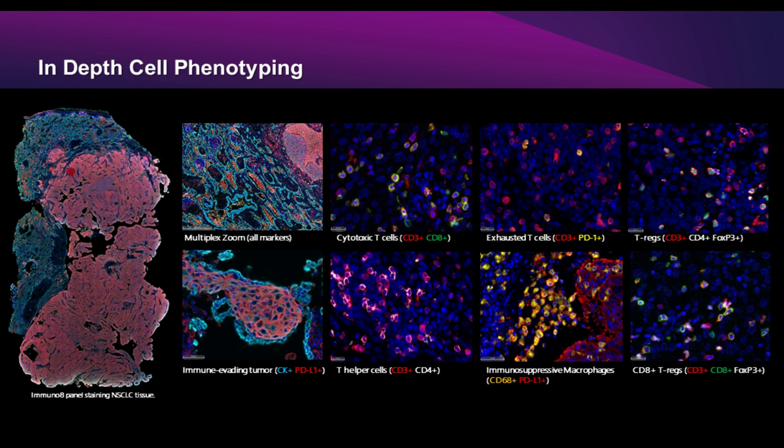Yeah, that's a great point, Scott. And just to add on to what you said, when you actually have to do spectral unmixing, it's required to balance the fluorescent signal for each one of the channels or each one of your markers, right? So that means in order to efficiently spectrally unmix the image, when you're turning up or turning down channels to get them within a specific range of exposures, you're artificially adjusting the amount of signal that's truly coming from the tissue or from the proteins present on that slide.